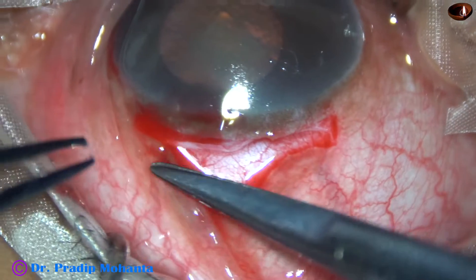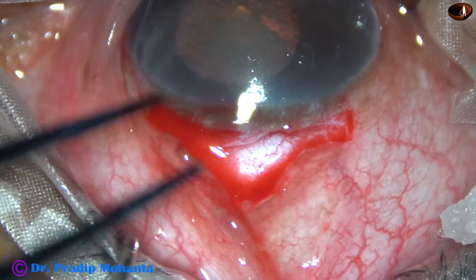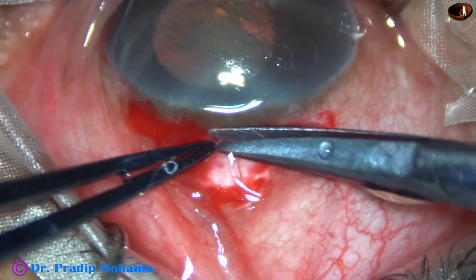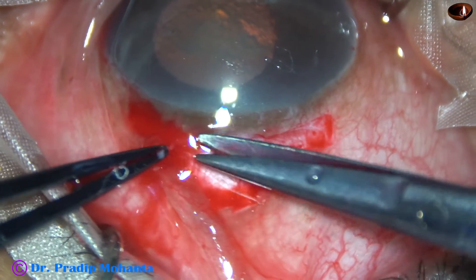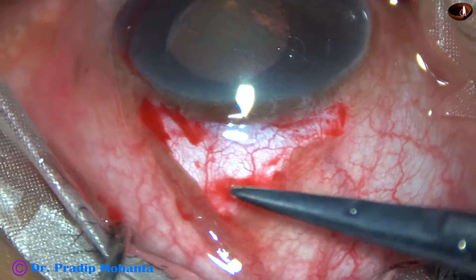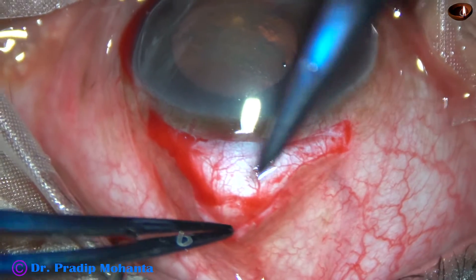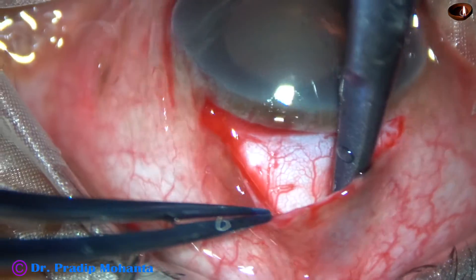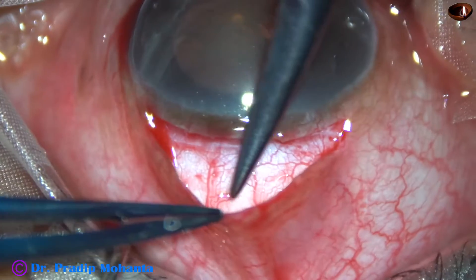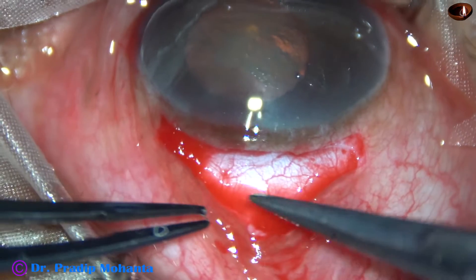Another small radial cut. See how thick the Tenon's tissue is — I am trimming the Tenon's so that I can do a nice cautery over here. Now the scleral surface is exposed backward so that the blade can work here, beyond the apex. The scleral surface has been exposed nicely.